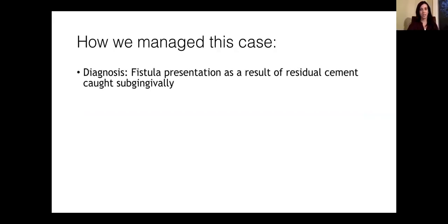First off, the diagnosis is basically it's a fistula that was presented as a result of residual cement that was caught subgingivally under the restoration. So the etiological factor has to be removed. We have to remove the cement in order to address the problem. And so this is how we addressed it.